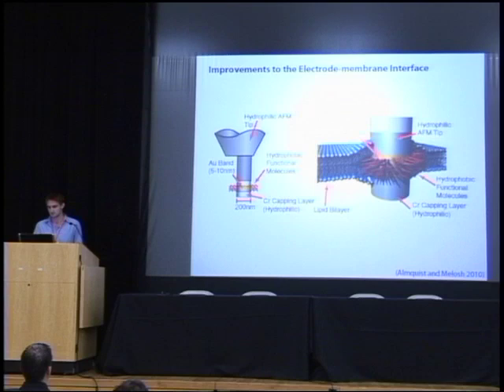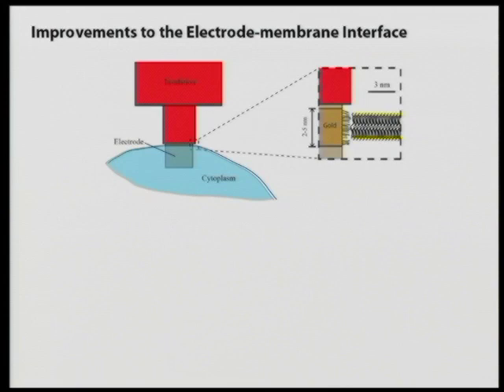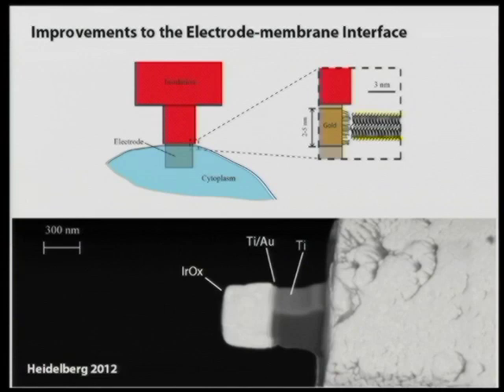So the idea is, jointly between Nick Melosh and Andreas Schaefer in Heidelberg, we're going to work on producing the same kind of electrodes that I've been producing with this special gold band at the border of the deinsulated electrode and the electrode insulation. And so it would look something like this. Now we've stopped using tungsten as an electrode material. We're using iridium oxide. It has a much lower electrochemical impedance, so it will also improve the signal to noise. I'll just quickly show you, this is an EM of such a probe that we've made in the last few months. And in the next few months, we'll be testing them in vitro. And I hope that this will yield some interesting results.